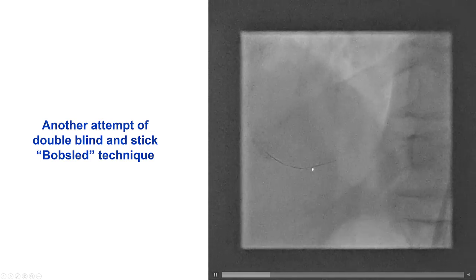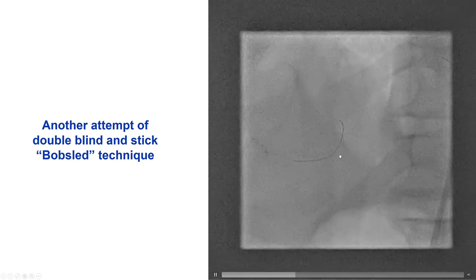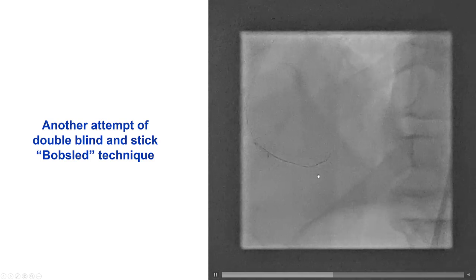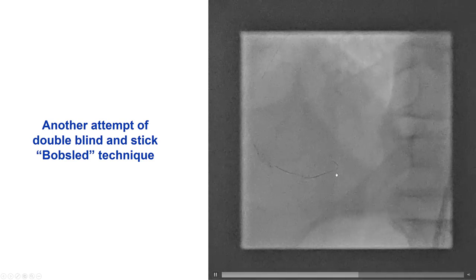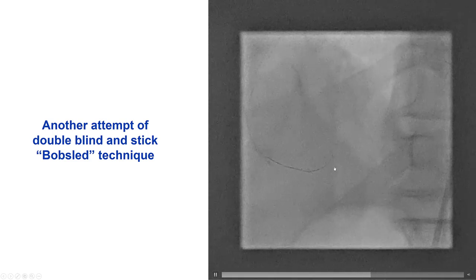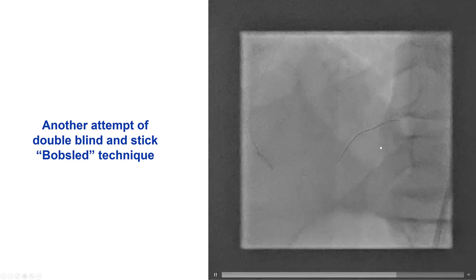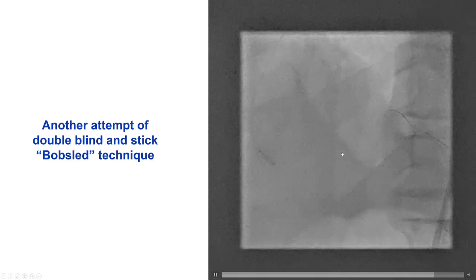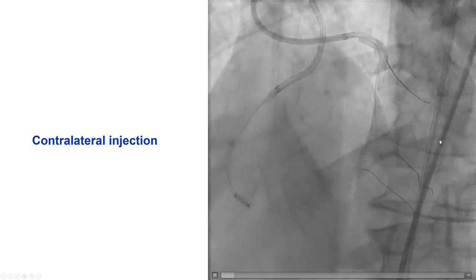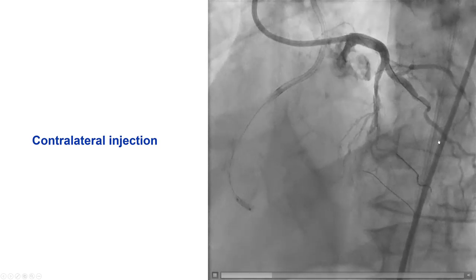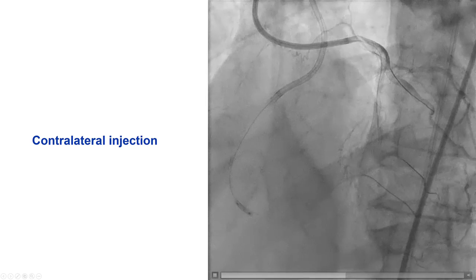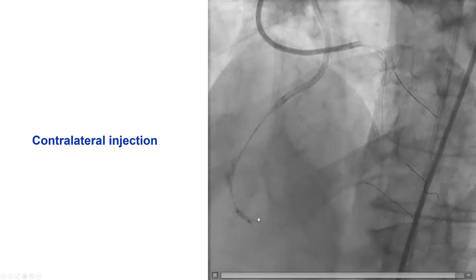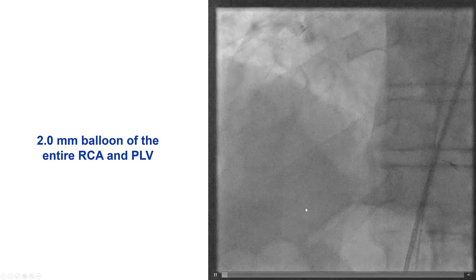We did re-entry several times. We tried the bobsled technique — trying a different location of the vessel in order to re-enter — and continued to have difficulty. The polymer-jacketed wire was initially advancing in the wrong place, but eventually it seemed to go along the course of the vessel. An injection from the left showed that distally the wire was in the true lumen, but the re-entry point was actually unclear.